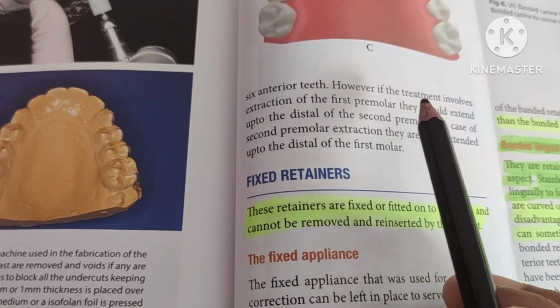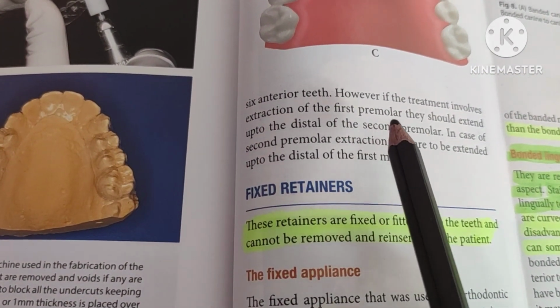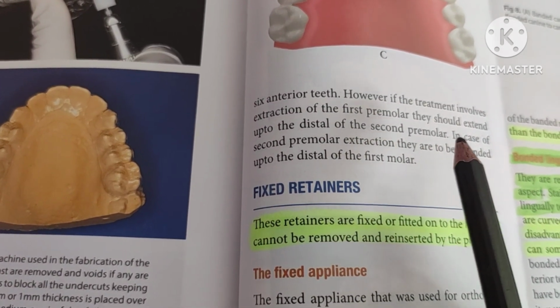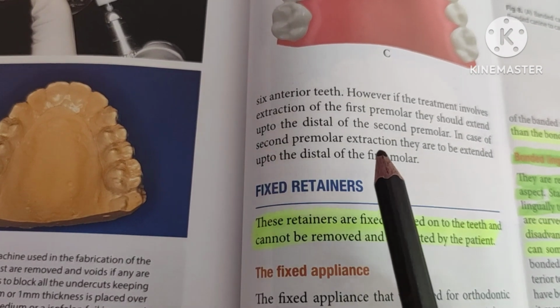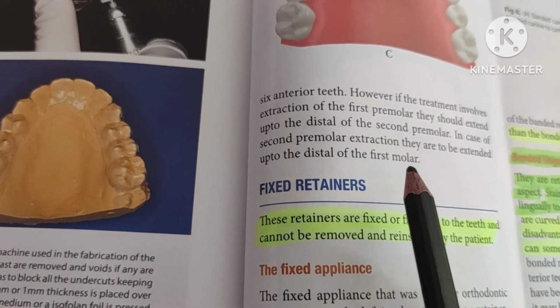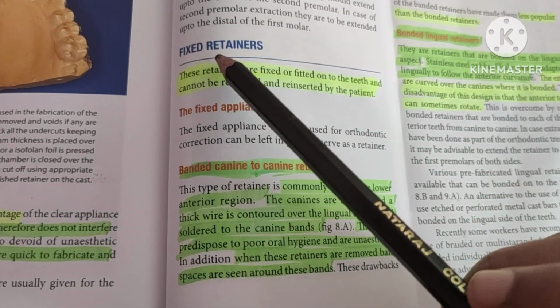However, if the treatment involves the extraction of the first premolar, they should be extended up to the distal of the second premolar. In case of second premolar extraction, they should be extended up to the distal of the first molar. The next is fixed retainers.